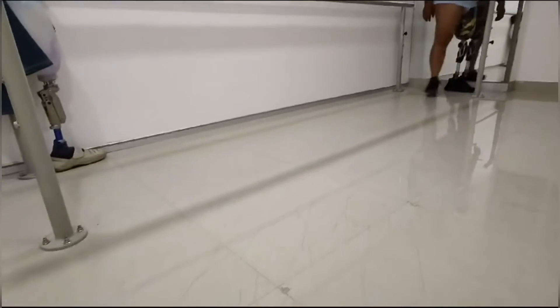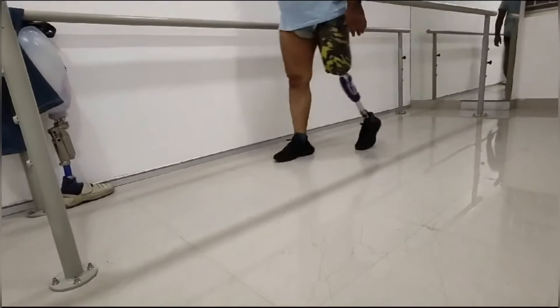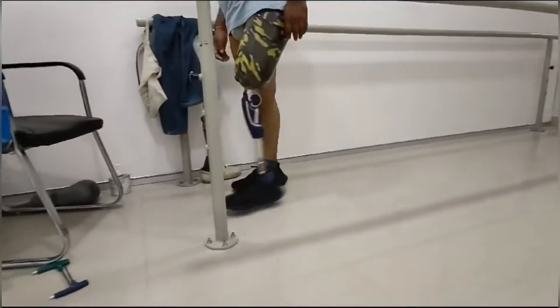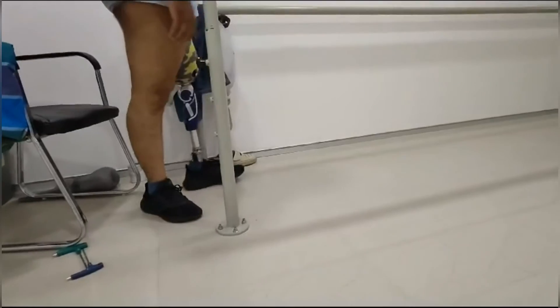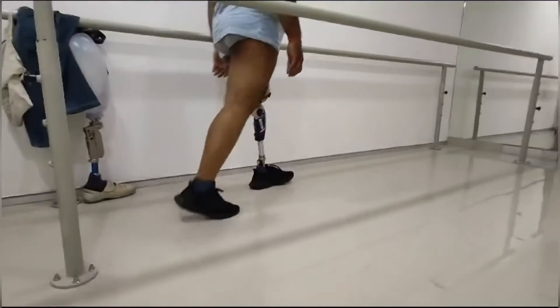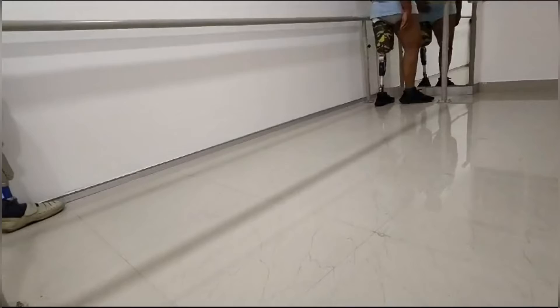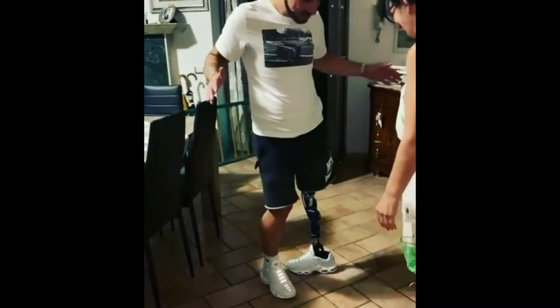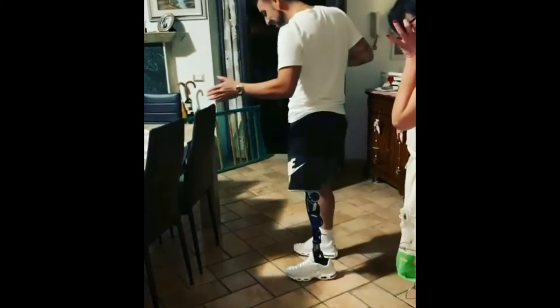In order to close the knee joint, you must straighten it completely and transfer your weight to your toes. Pull the lock lever down. Make sure the lock is closed. To adjust the stance phase, remove the black cover on the rear of the knee joint. Stance flexion resistance is adjusted by the lower adjustment ring, while the on/off threshold is adjusted by the upper adjustment ring. Flexion and extension are adjusted independently of each other.